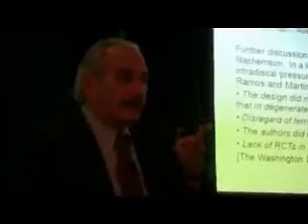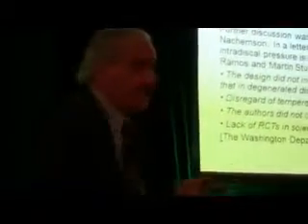In all of my research, and the more I work with ExtendTrack, the more I believe that ExtendTrack works and flexion distraction works on the principles, and even linear tables may work on the principles of chiropractic, reducing subluxation and mechanical failure. There is no correlation between improvement of symptoms and lowering of intradiscal pressure. It's a phenomenon that occurs when you stretch.